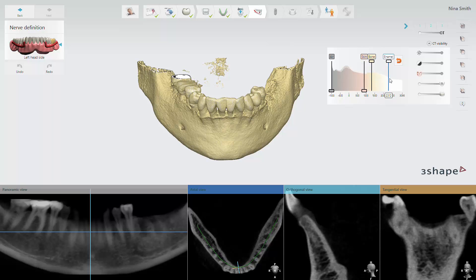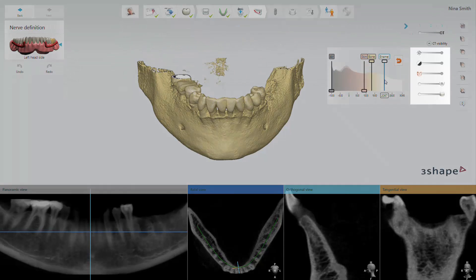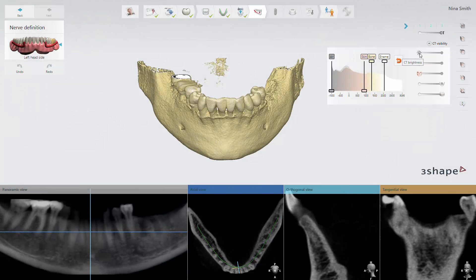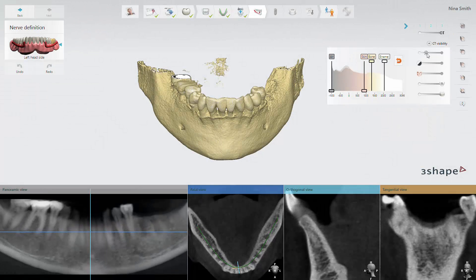You can do the same with the enamel slider. You can also modify the CT brightness and contrast to get the best visibility of the necessary objects in 2D view.